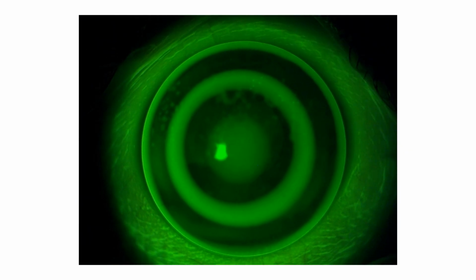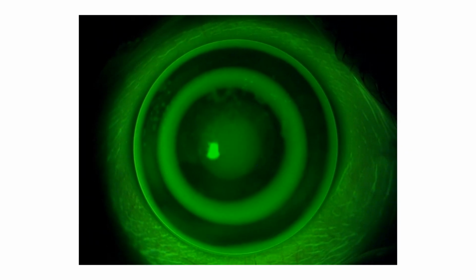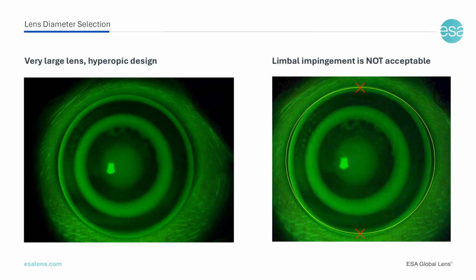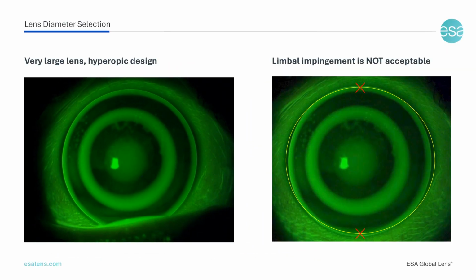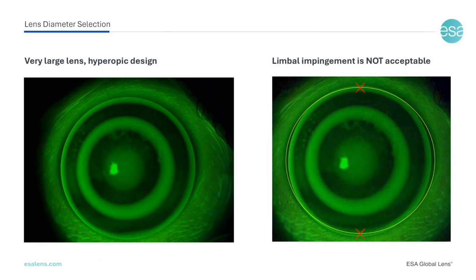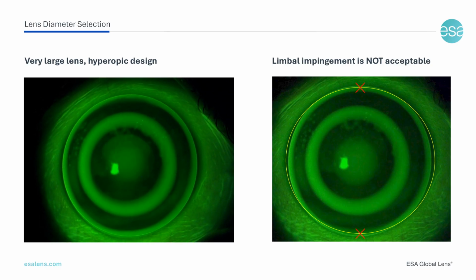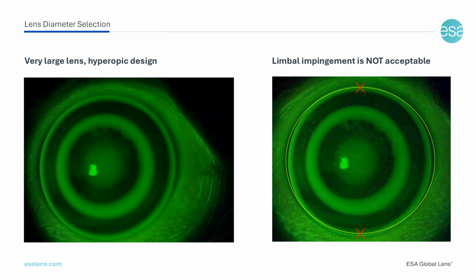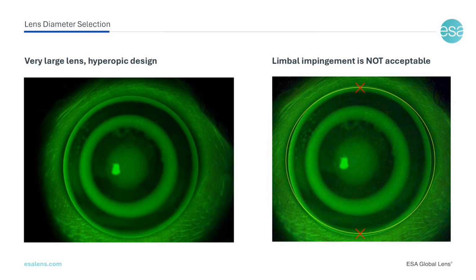The lens must never infringe upon the limbus. This is not only due to possible undercorrection, but also because prolonged mechanical impact can damage the limbal stem cells, which can compromise long-term corneal health. While scientific evidence regarding the long-term impact of Ortho-K lenses on the limbus is currently absent, avoiding mechanical contact is advised as a preventative measure to preserve the integrity of the corneal growth zone.